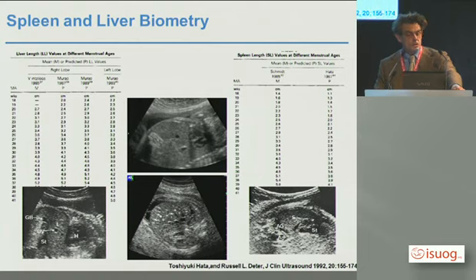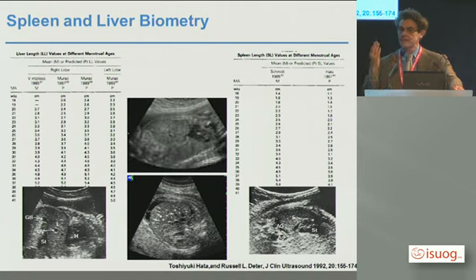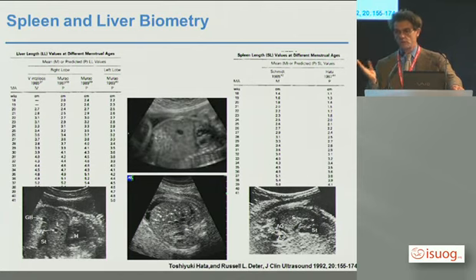The way to measure the liver is not really anatomic, and this should change with MRI, but so far you go for a parasagittal plane from the gallbladder up to the diaphragm, drawing a straight line. Everything below 4 centimeters in the second and early third trimester is normal.